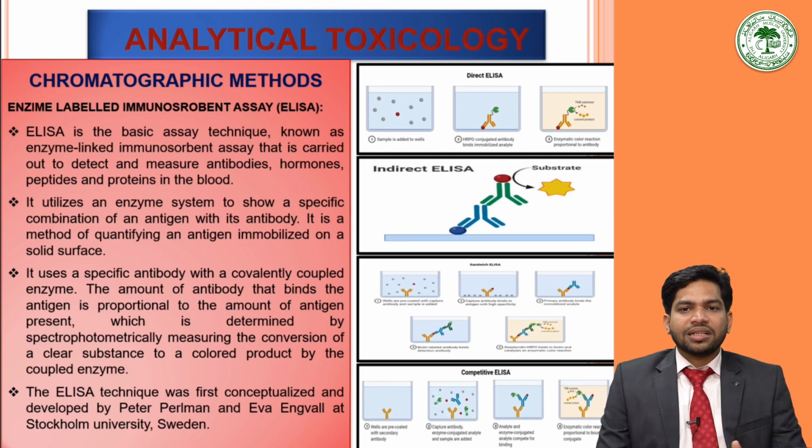To overcome this issue of ELISA, antibody-fluorophore conjugates have been developed that have the potential to eliminate this problem, because the fluorescence of the immunocomplex can be measured directly on the surface or inside the solution. So this ELISA technique or the immunoassays is useful for poisons that have immunogenic properties. Some poisons, like snake venoms, are immunogenic themselves and readily amenable to immunoassays.